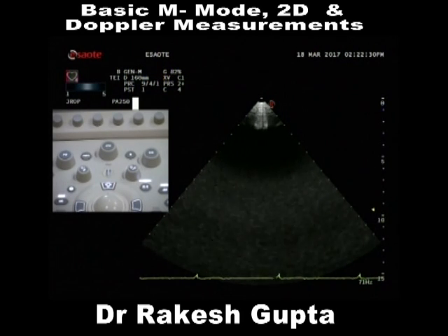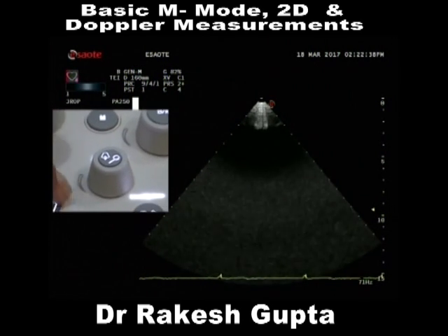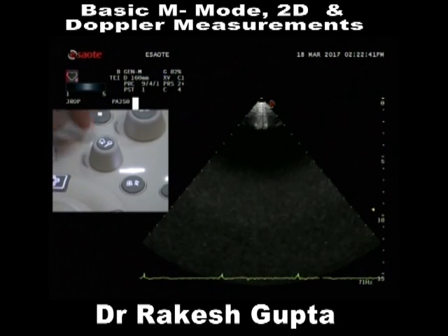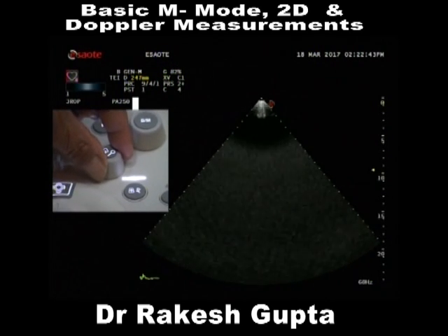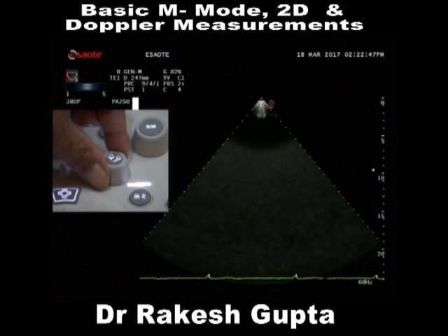Listen, 15 centimeters of depth. I say increase the depth. So let's look at this knob over here. It says depth, written just behind. If I am increasing, look, my depth is increasing to 20 and I'm seeing more of the structures.